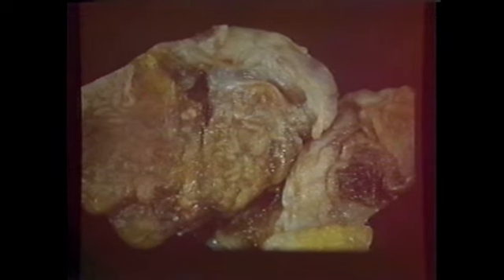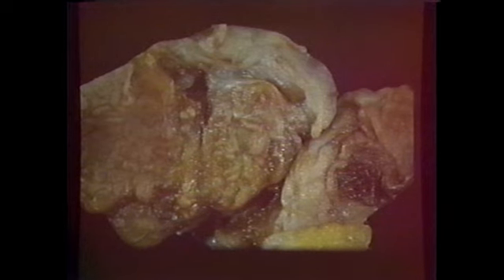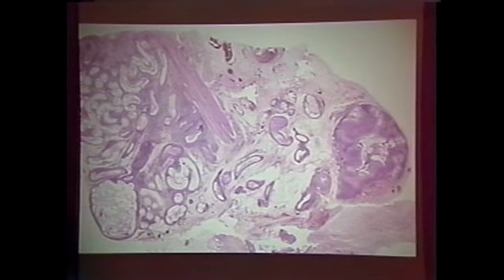This is a nodule from a dog from California. I was told that this is the dog in Dances with Wolves, the dancer, if you will. He presented with this nodule from his eye, and there it is in higher magnification. When you see nematodes, these things kind of look like worms. You have a little clear area and a kind of whitish area. The whitish area usually is the worm, the nematode that's coiled around. You see that? And the clear area is kind of like the reaction, the fibrosis or whatever, to the worm itself.